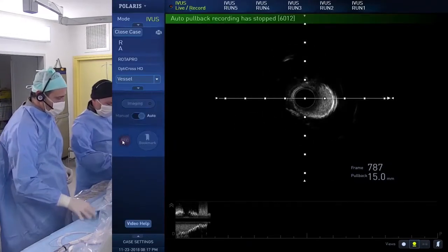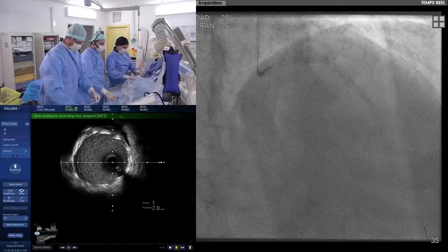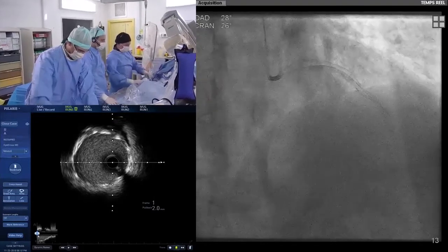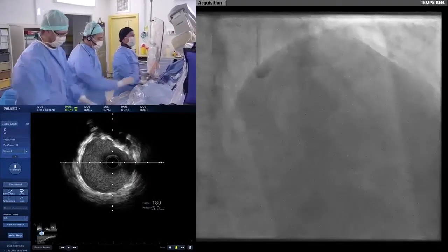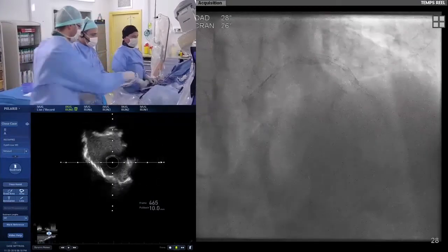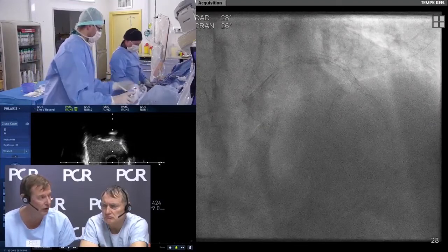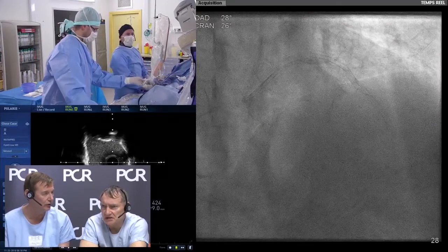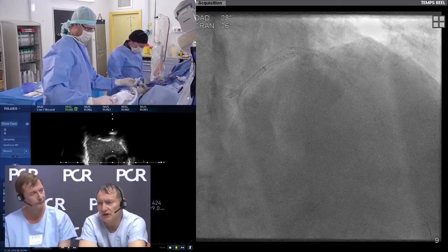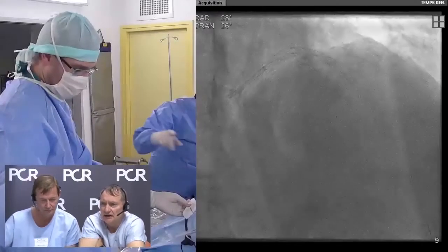So just to be sure, are you okay if we don't manage the circumflex artery? I mean, we don't do any kissing, is it okay for that? There's quite a lot of trial data showing that you've got TIMI 3 flow with no restriction to the circumflex. It looked like a very good angiographic result. You wouldn't go up to that. In my mind, I prefer to stop because after you have a difference of caliber between... I just want to assess the size of the LAD and left circumflex in the mid part.